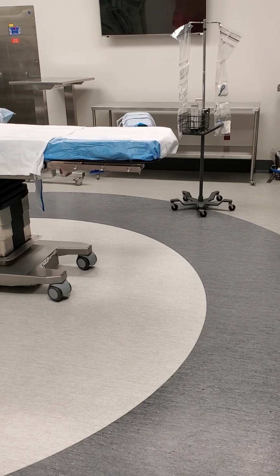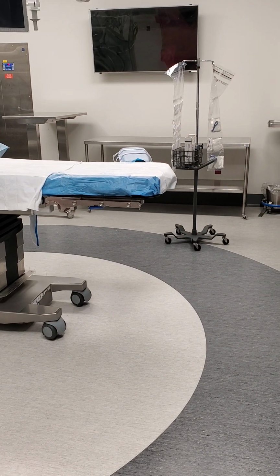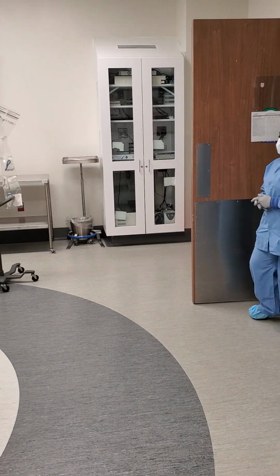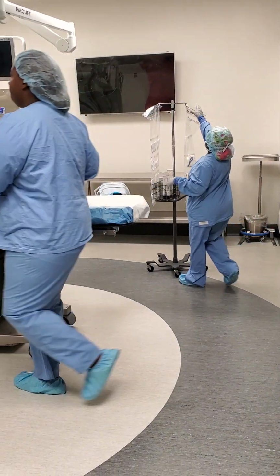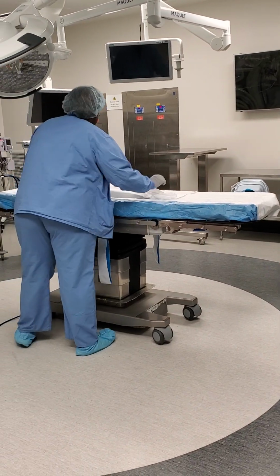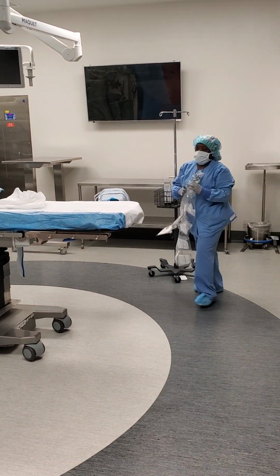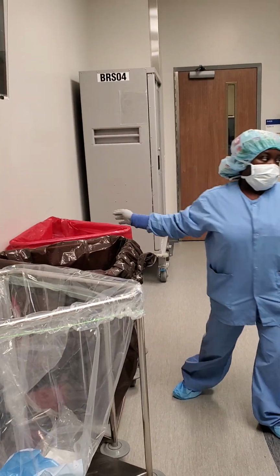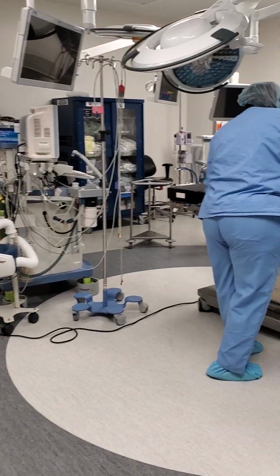We're here today to discuss room turnover. The patient has just left the room and the SSTs are arriving to clean the room. As they come into the room, they're going to be taking down all the disposable items and putting them in the trash. Make sure to take all laps and Ratex and put them in the red biohazard bin no matter how much blood they have on them.